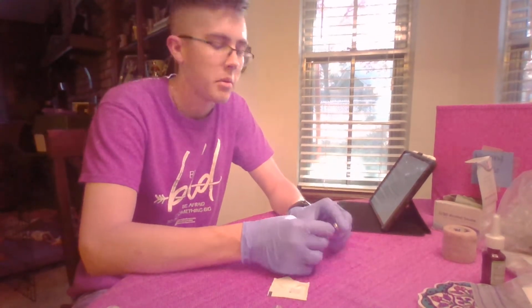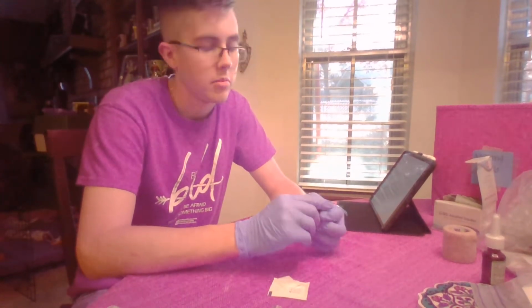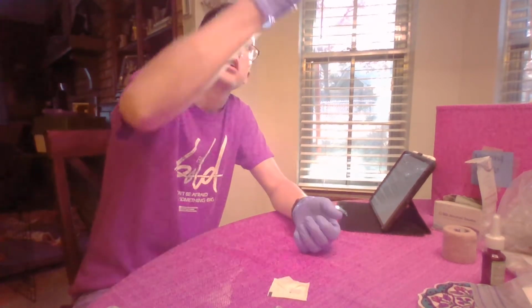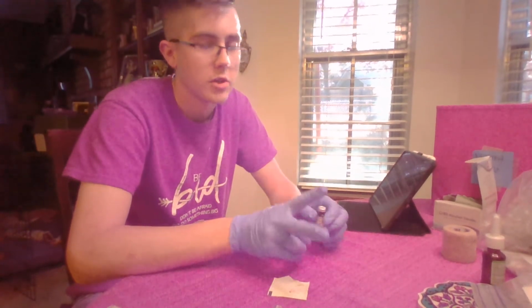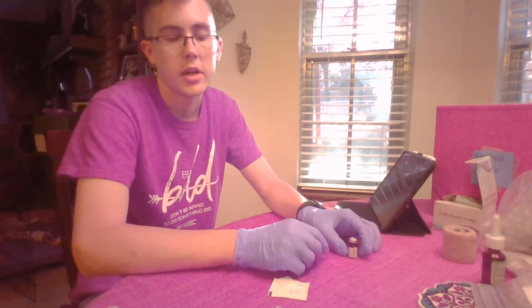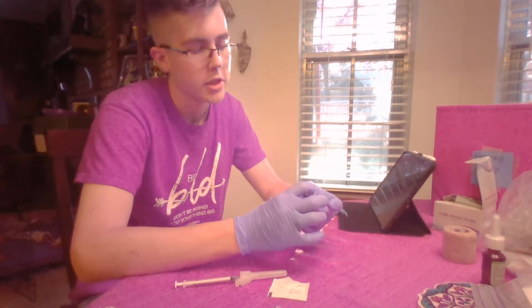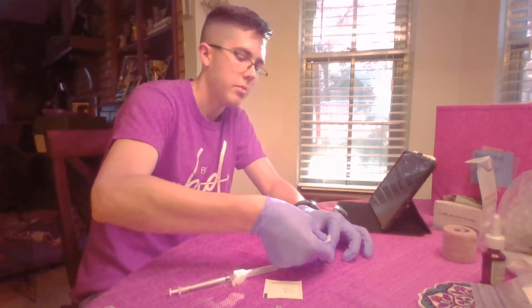Next, what I will do is I will find my medication, check that it's the right medication, that it's the right dose of it. I'm going to be able to give it the right route so I can give it intranasally. Next, I will be making sure that I have the right amount. I will check the clarity of it as well as the expiration date, and I will check with my 2 patient identifiers to make sure that I'm giving it to the right patient. Next, what I will do is I will assemble my materials. So I got my needle, check my medication one more time. It's correct medication. Clean the top of it.